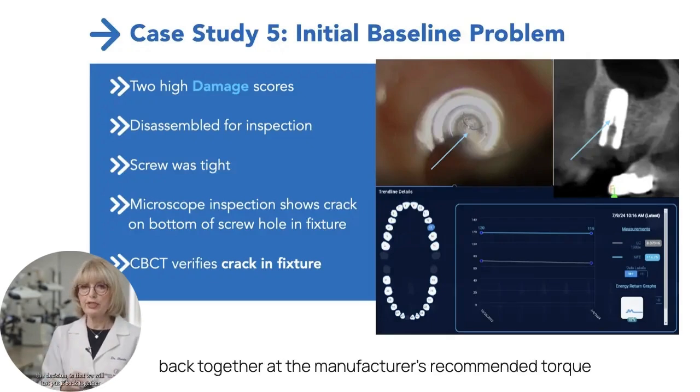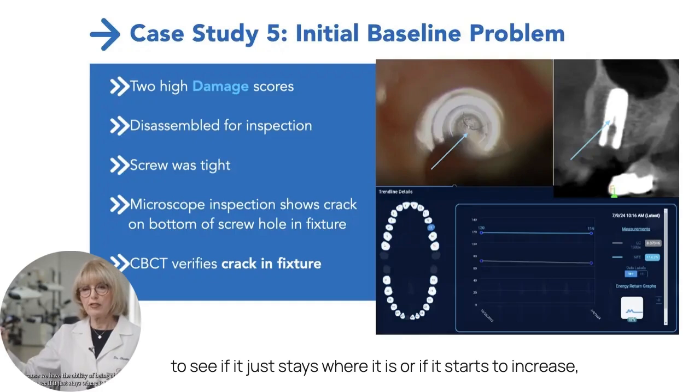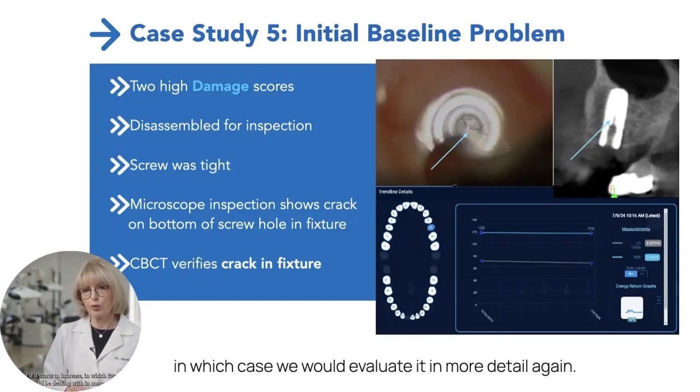we will just put it back together at the manufacturer's recommended torque and monitor it, because we have the ability of being able to see if it just stays where it is or if it starts to increase, in which case we would evaluate it in more detail again.